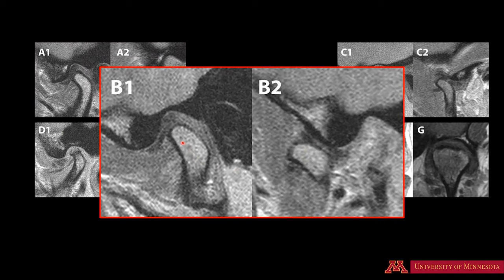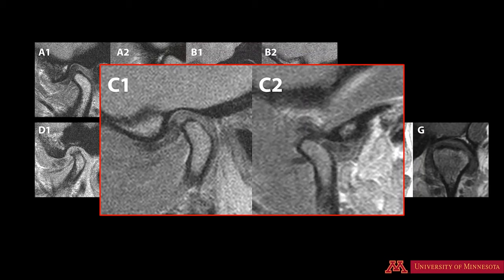In the next case, here is the condyle, articular fossa, and eminence. This is the posterior band of the disc. The central zone is anteriorly located, not in contact with the condylar head, so we'll call this as indeterminate. In the open mouth, the disc reduces back to normal relationship — the condyle, articular eminence, and disc is bowtie shaped.